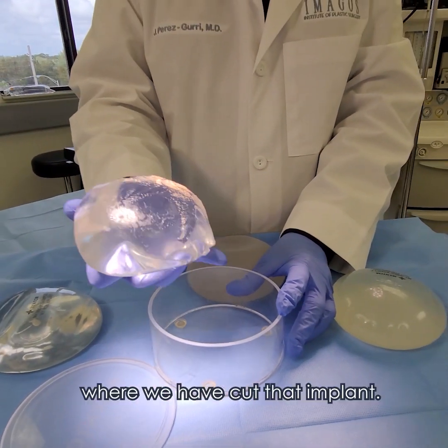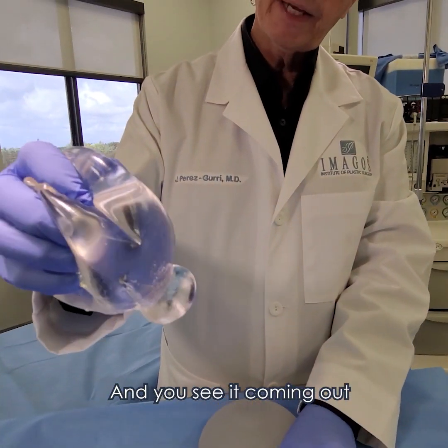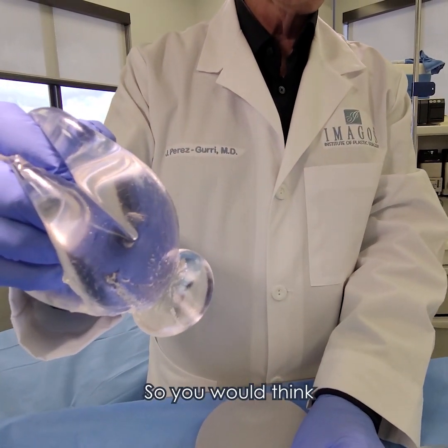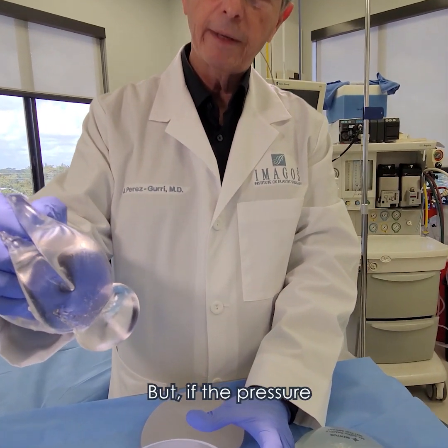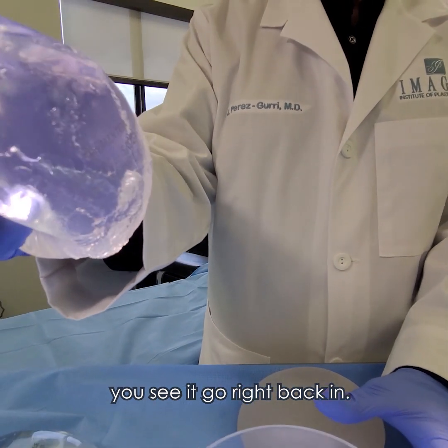So you can see where we have cut that implant and you see it coming out — you would think, oh my god, that's going to fall on the table — but if the pressure is released, you see it go right back in.